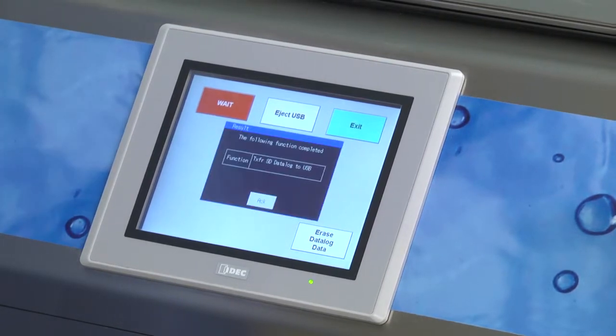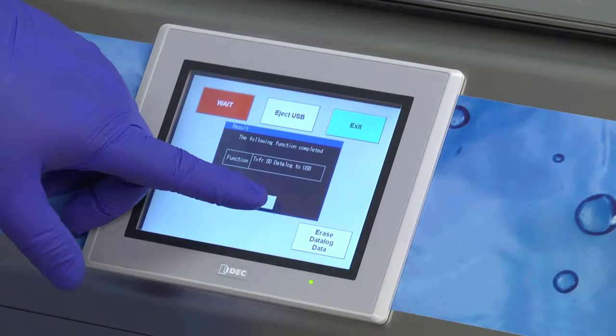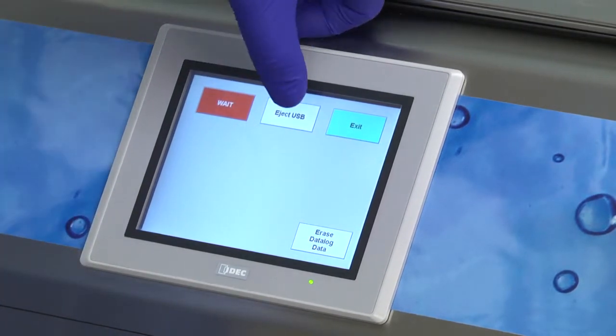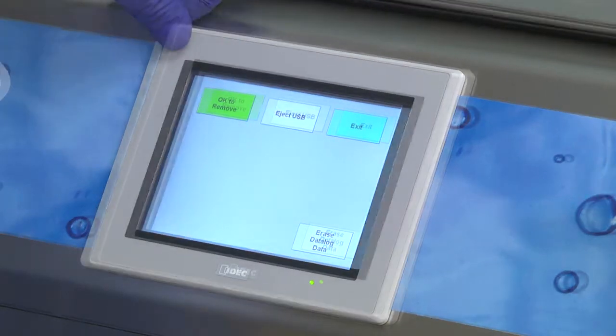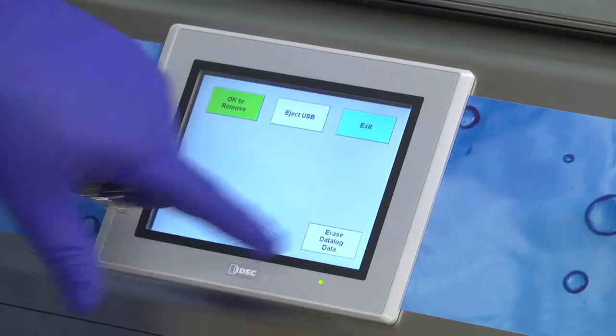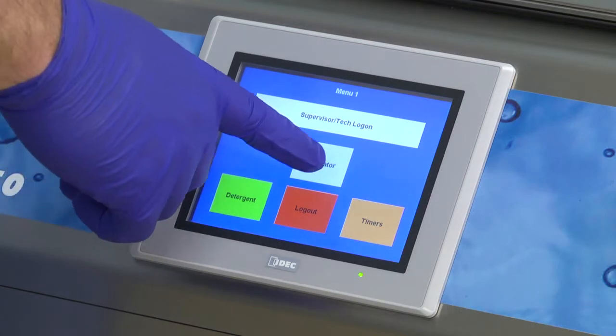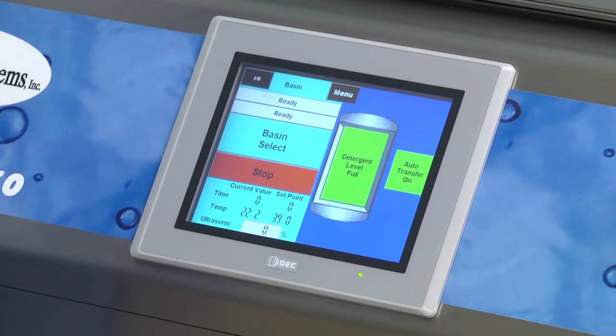Once the data is transferred, press Acknowledge and then cancel out of that menu. Press Eject USB to remove the thumb drive and, if desired, select Erase Data Log Data. To begin a cycle, go back to Menu 1 and press the Operator button, which will bring up the Basin Select screen.